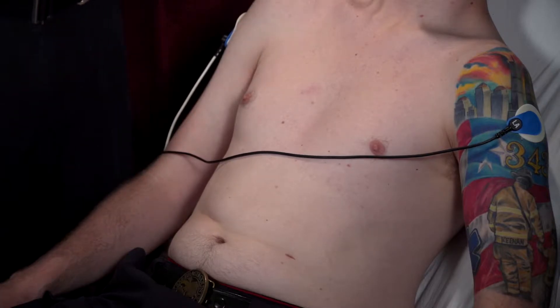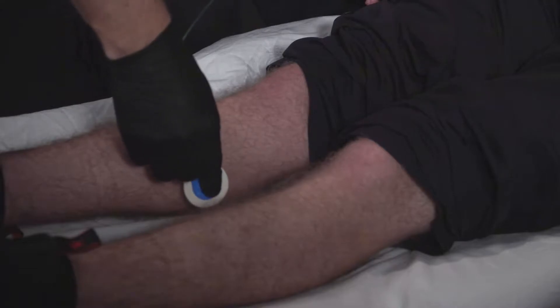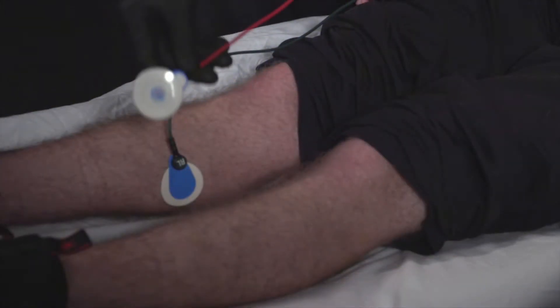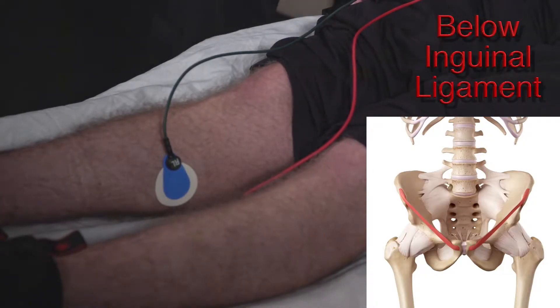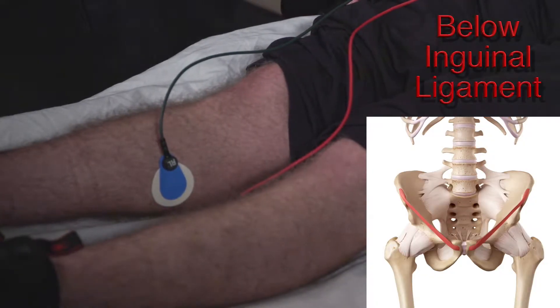We don't want our 12 lead placement to interfere with all the other treatments we're doing. The important thing to remember with limb leads is they have to be on the limbs outside of the torso. Then we're going to put these lower limb leads on the legs, and remember the important part is that it needs to be below the inguinal ligament.